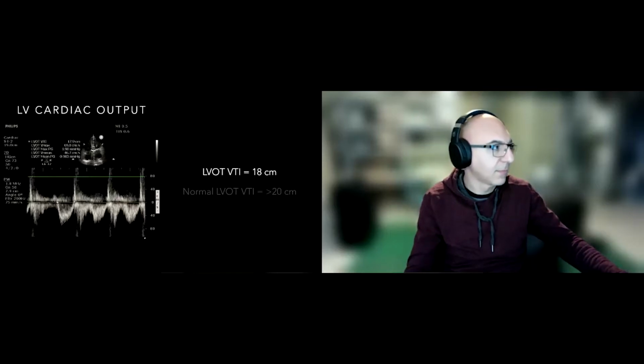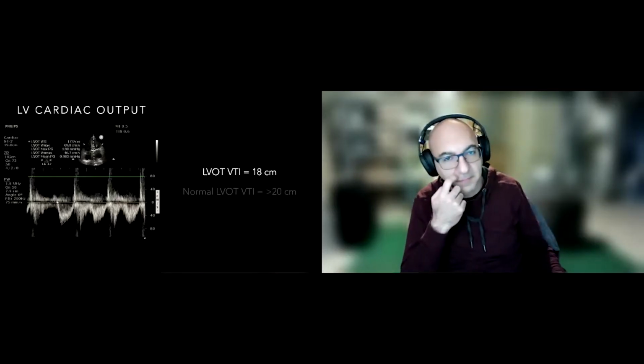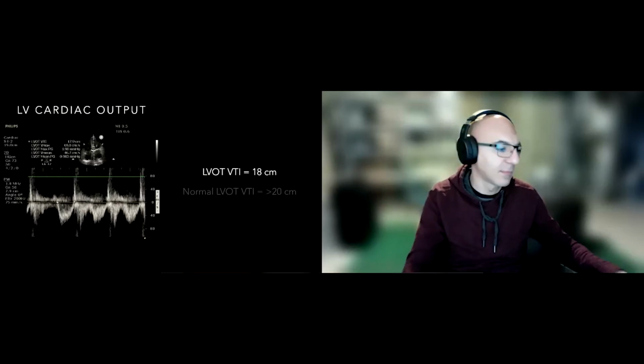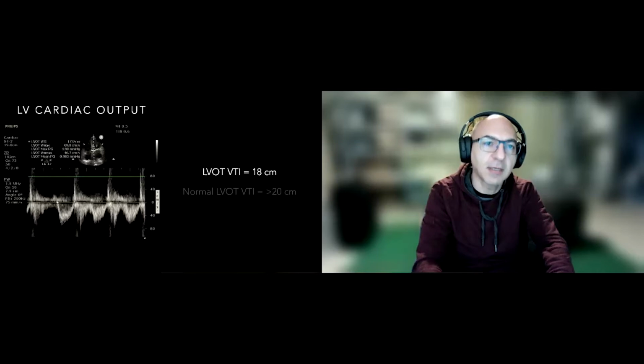But there's maybe another example of where you'd have discordance between the two different values of LV function. Am I thinking right there, Z? Correct. Yeah, exactly. Matt, that was a good example.